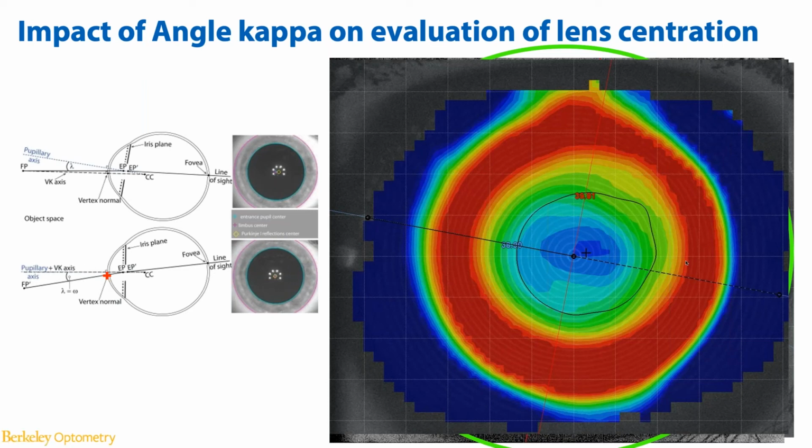So the eccentricity, the width, and the magnitude, all three are, at least in animal studies, playing a role in terms of the overall anti-myopia efficacy. Currently, we don't actually know what's the best combination. But I do want to say that striving to achieve a smaller treatment zone at a significant cost of losing visual performance, especially at dawn and dusk or with nighttime glare, is probably not fully supported based on the evidence we have so far.